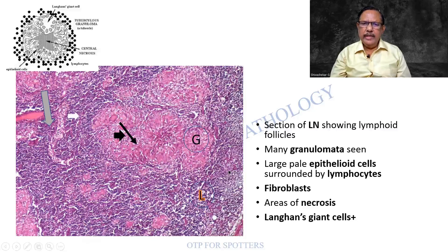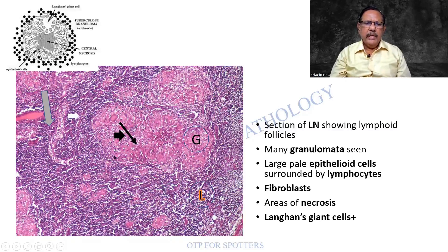This is a microscopic slide in which I am able to see lymphoid follicles. Look at this region — there are a lot of lymphocytes here. But what is important is there are multiple large areas that are well-circumscribed, joining together to form map-like areas again. There are a good number of Langhans type of giant cells.